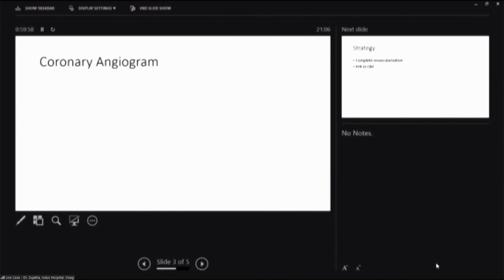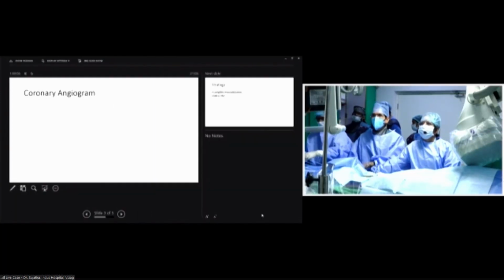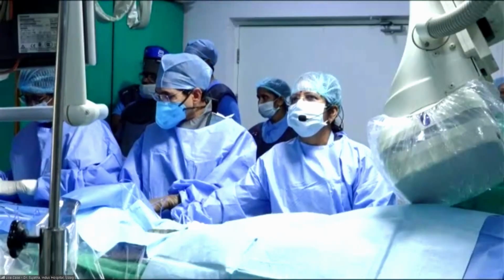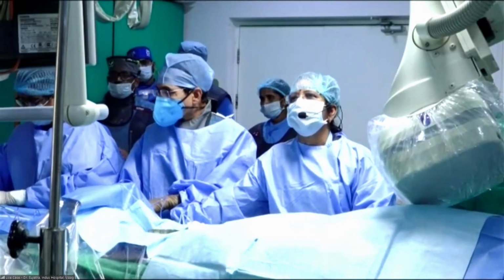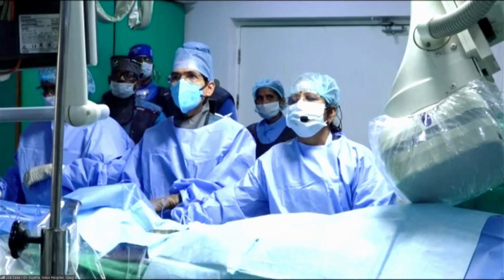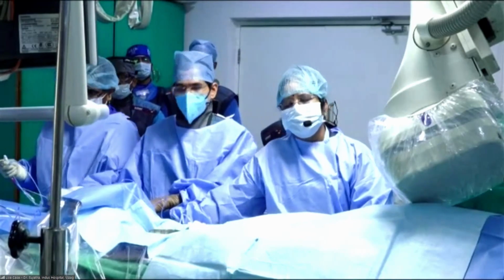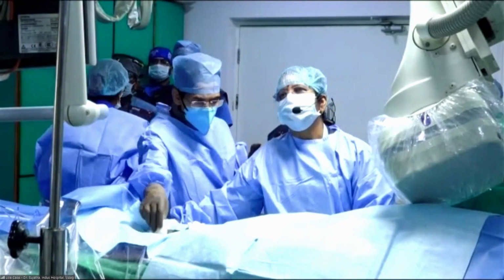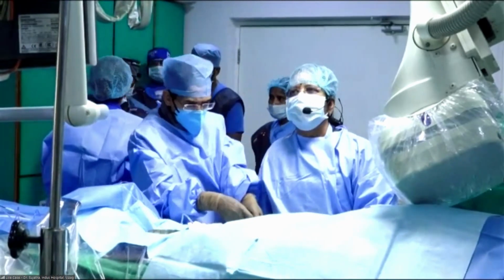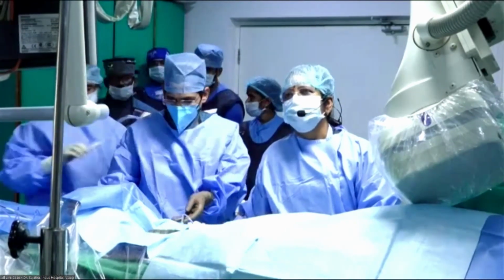OM1 needs to be fixed before proceeding to LAD crossover stenting. Yeah, that's an important point my colleague is mentioning here. If you decide it, we have to finish it before, because if you do crossover, it will create trouble to access the left. So you want to fix the small OM also below? Ma'am, the primary PCI has been done in the same setting? No, sir. It was done about 2 weeks back. Yeah, then it's fine. So now we finished the RCA 2 weeks back, and now should I treat the small OM also? It's a small territory.